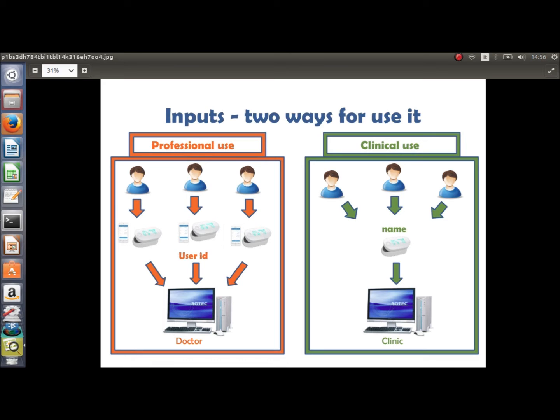The second way is used in a clinical context, in which just a few sensors are necessary and they are used to take measurements from all patients. In this case, user ID cannot be used since it will be the same for all of them. So, the patient name is required and passed as an argument to the program, which does all the work under the name provided.